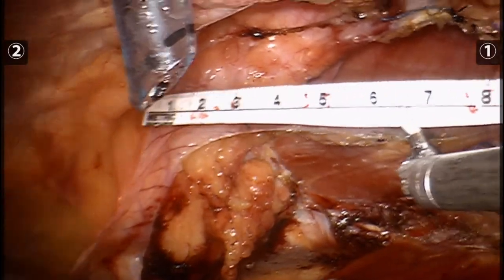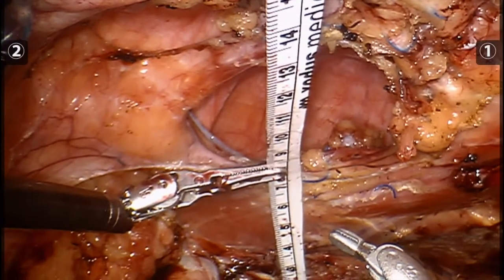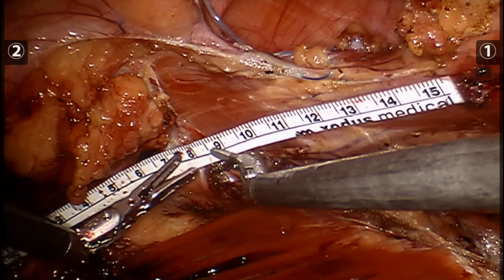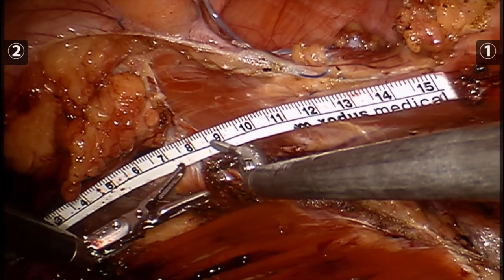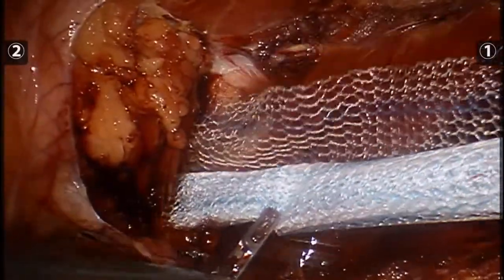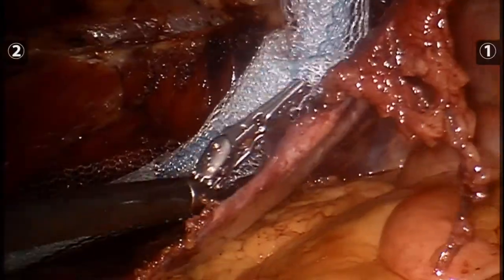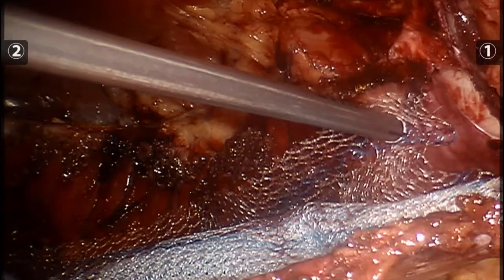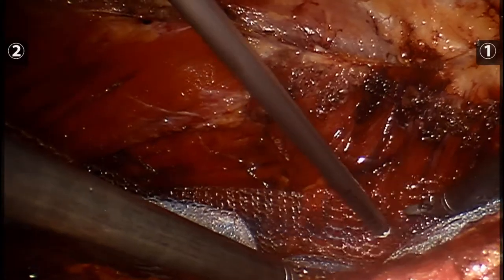We then measure the length and width of the hernia defect, as well as the dissected space from the posterolateral abdomen to the midline. With these measurements, we deploy our mesh to the dissected side. This is a 30 by 35 sheet of Prolene Soft. Suture where we can't feel, and tacks where we can.